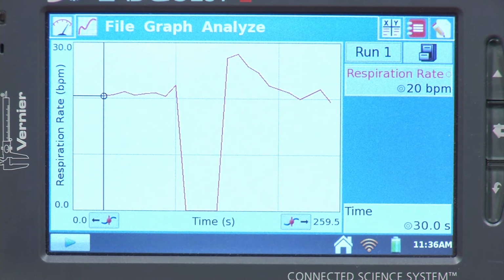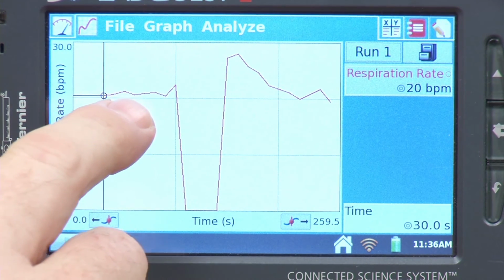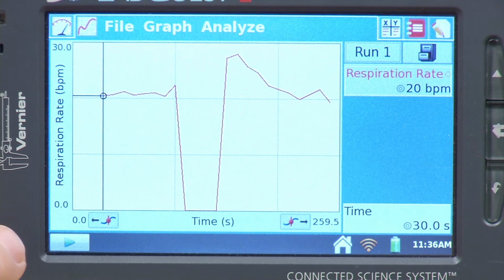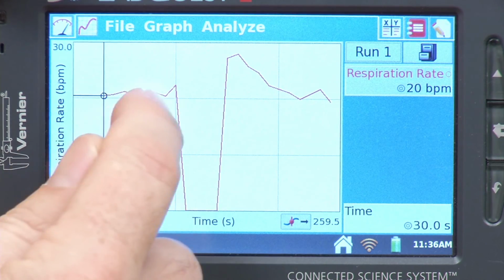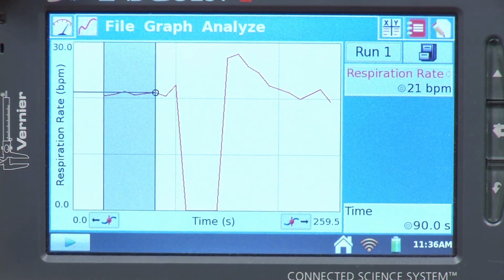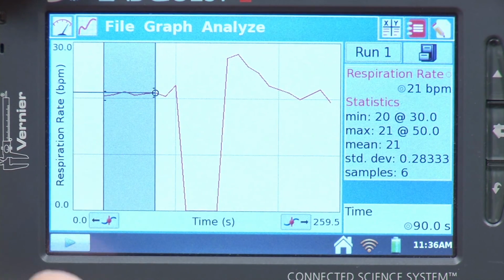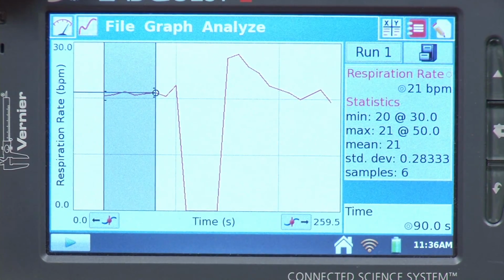Now we have some data, and we might take a look at it. So this portion of the data is where I am just breathing kind of normally there. And we could do a couple things here. I might be interested in the stats maybe of this region. Maybe I want an average value for that region, so I'm going to highlight just a part of that region there. You can go under Analyze and do Statistics. Check the box next to Respiration. So the mean breaths per minute there was 21 breaths per minute.